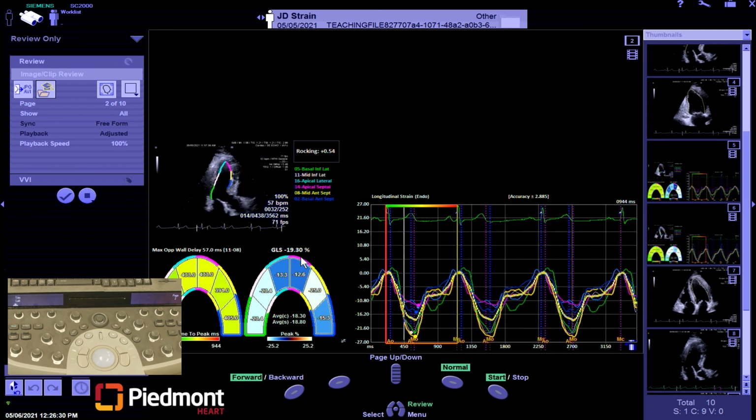If, in fact, this is a very important patient that ideally you think needs strain processing done, and it's not tracking or not doing something correctly, the thing I would suggest is first, don't let the patient leave just yet. Go ask a senior sonographer or a fellow coworker to come and take a look.